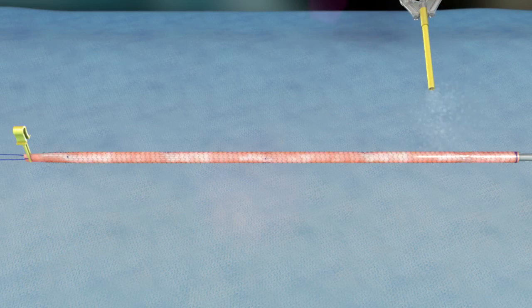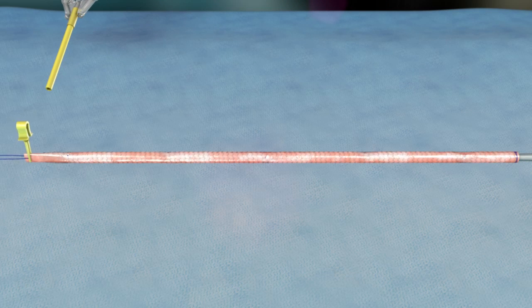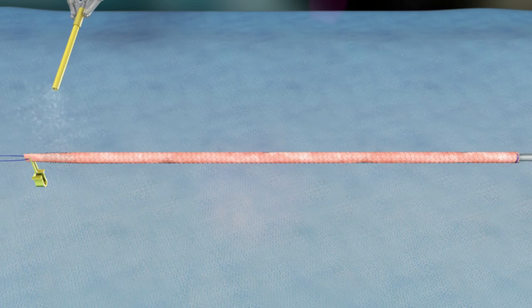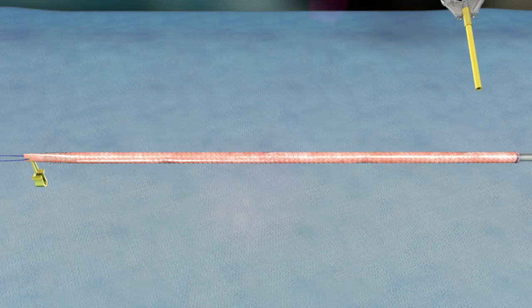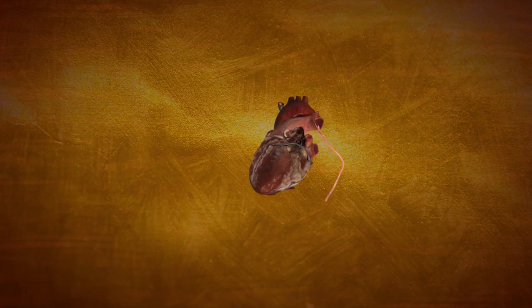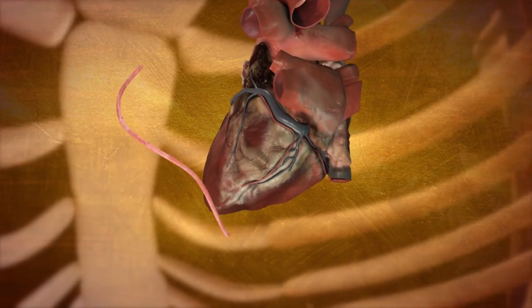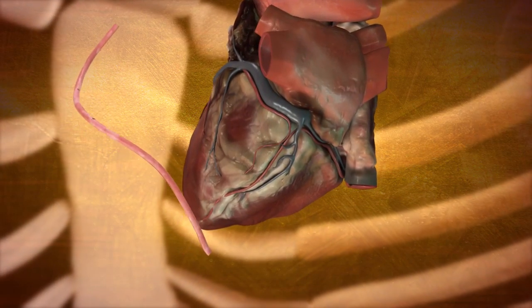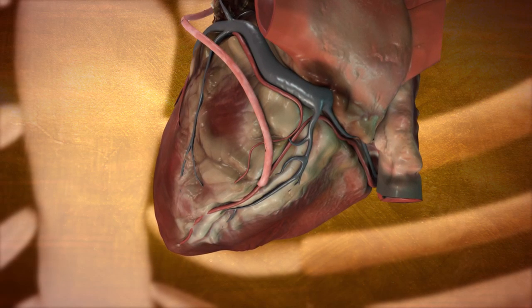Dry the entire surface of the graft with a lap sponge or towel and then apply a thin coating of fibrin sealant to the entire surface of the vein and mesh. Rotate the vein to ensure complete coverage. Allow the sealant to dry as per the manufacturer's instructions for use. The saphenous vein with the ESVS mesh is now fully prepared and can be stored prior to implant by gently covering it with a moistened sterile towel or placing it in heparinized saline solution.